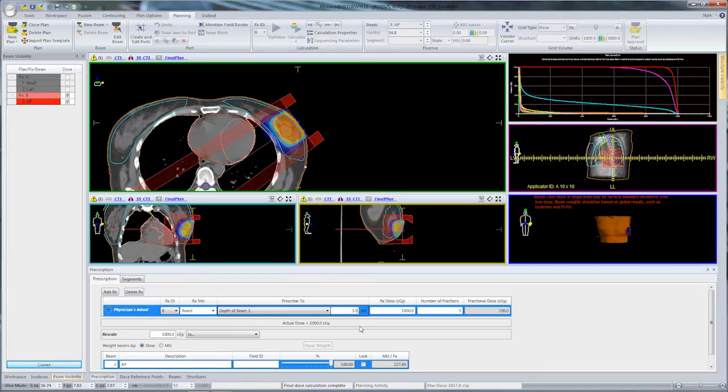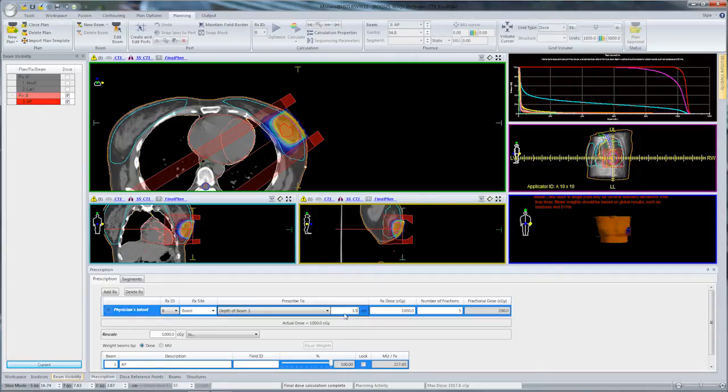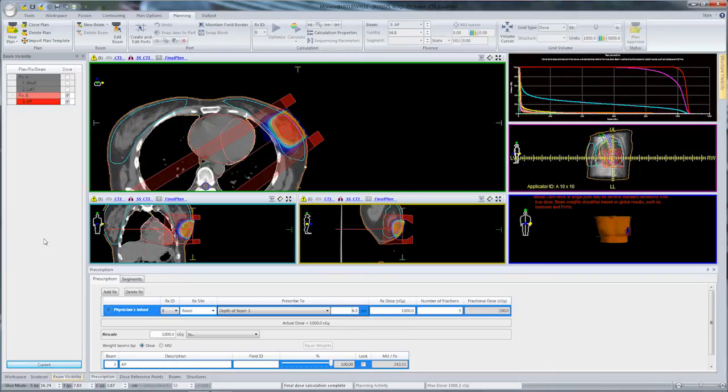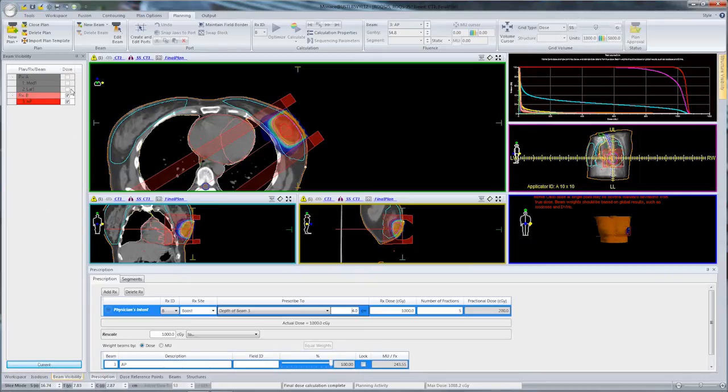Once we're happy with the dose that RxB is receiving, the next step is to display RxA and RxB together. I'll turn on the dose and beams for RxA.